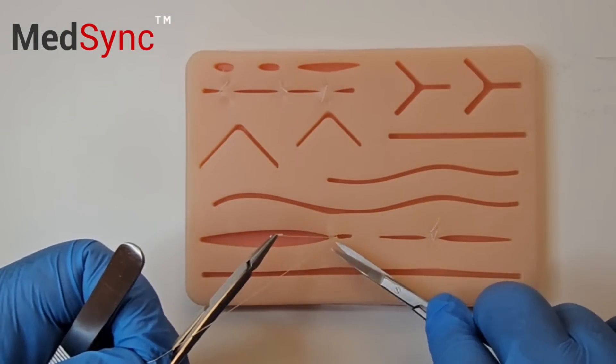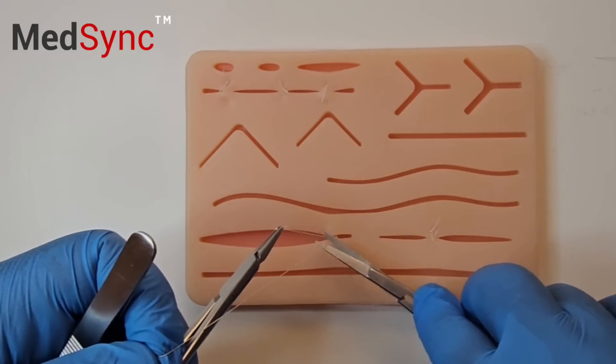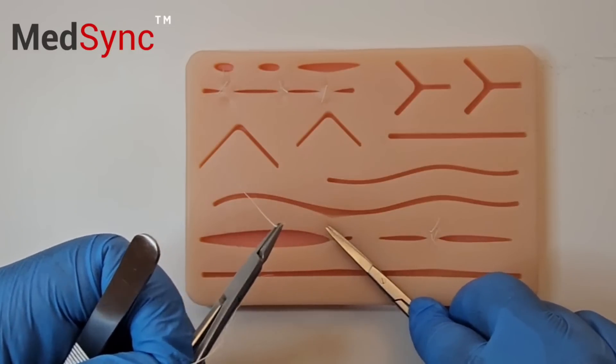You cut flush with the skin above the knot so you can't see the suture ends. You open, slide down, angle it and cut.